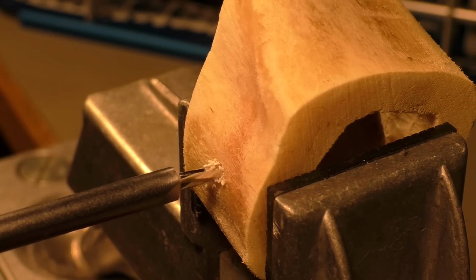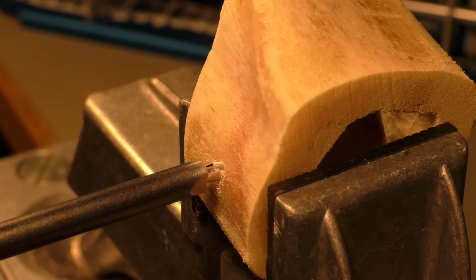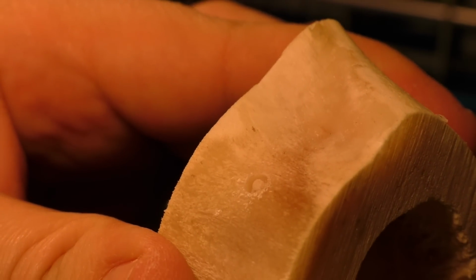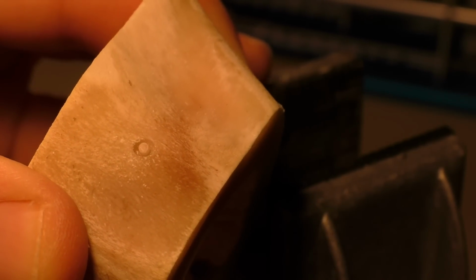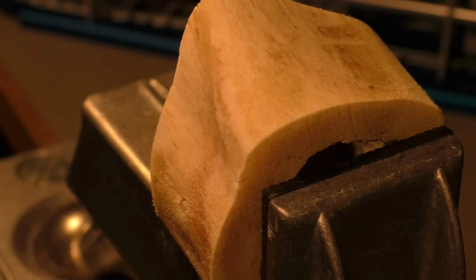And normally, as I said, this drill dust here would be flushed with water through this hole in the drill, but I don't have this possibility here. So let's see that. Okay, that's how it drills. Okay, I hope you can see that, yes. So it doesn't drill a hole, it cuts out a little bit of that bone. Let's go ahead and see how well that works.